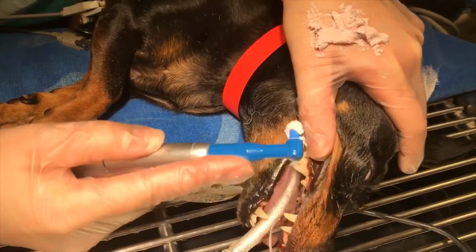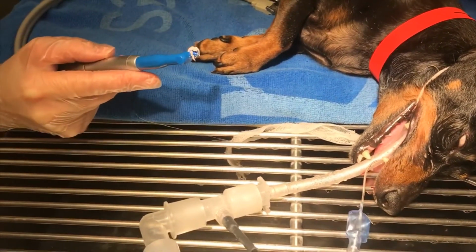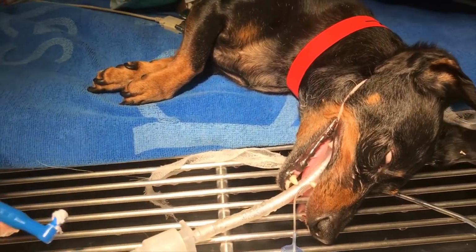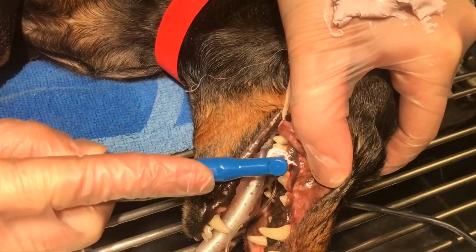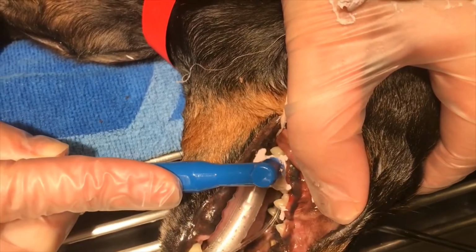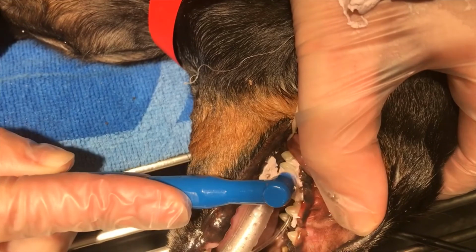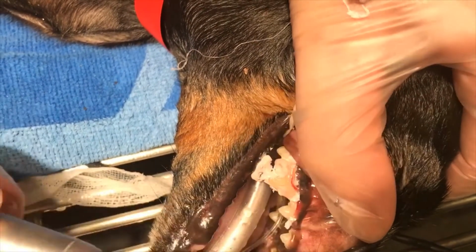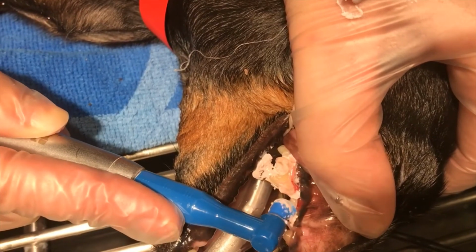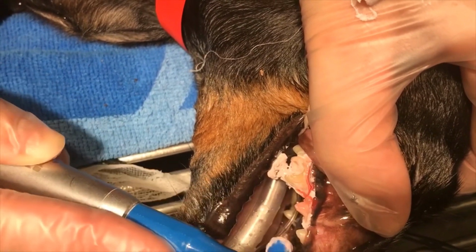When you are applying pressure, you want to apply enough pressure to the tooth that the edge of the cup stands out. You want to do smooth movements back and forth. You don't want to jerk. And you want to gently fan out so that the edge of the prophy cup does go under the gum line, as you did scale there. Some things to note.